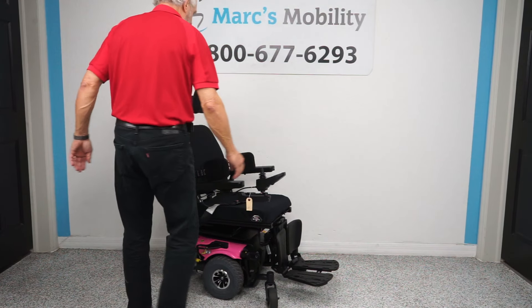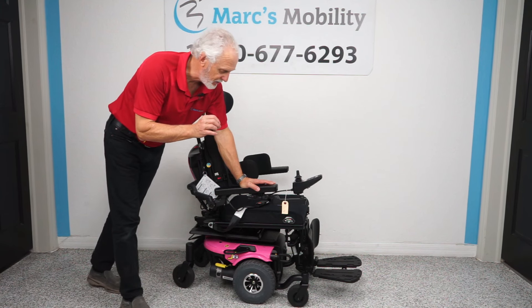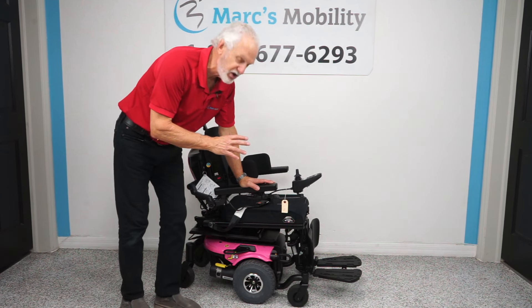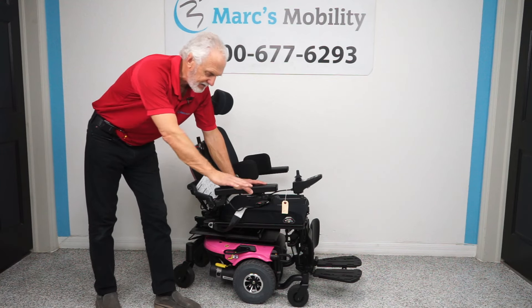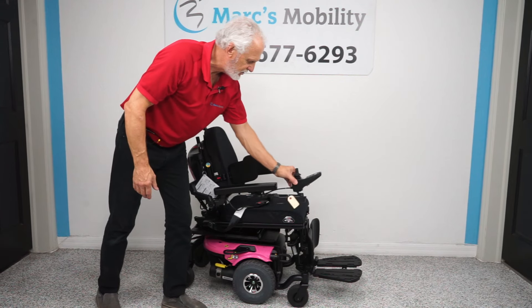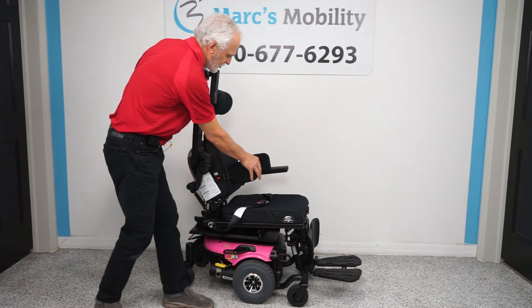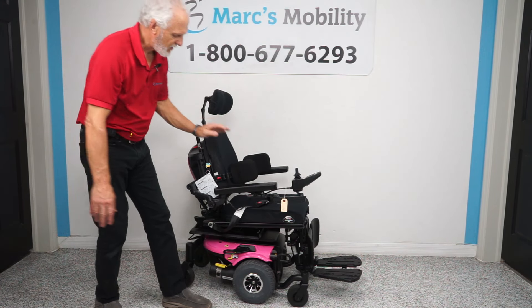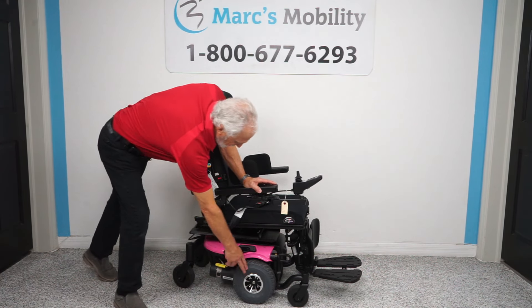Let's recap. This is a J6 power chair made by Pride Mobility, one of the largest wheelchair manufacturers in the United States. This power chair has six wheels on the ground. It has electric tilt and electric feet, the swing-away joystick, flip-up arms, cushions, lateral chest guard, safety belt, adjustable headrest, solid tires, anchor points, and direct drive motors.